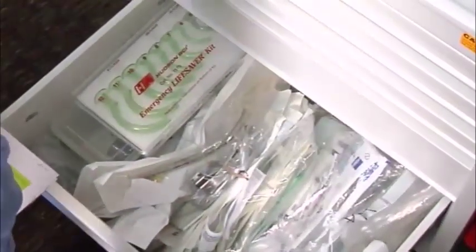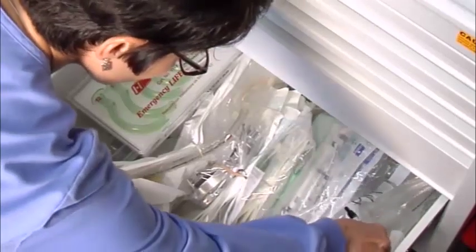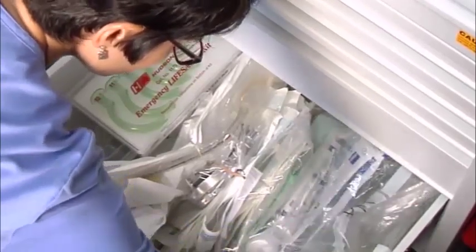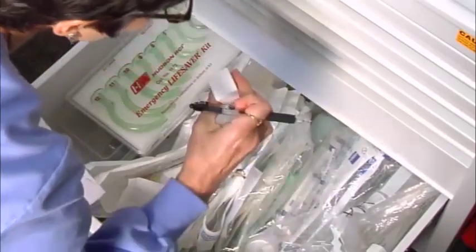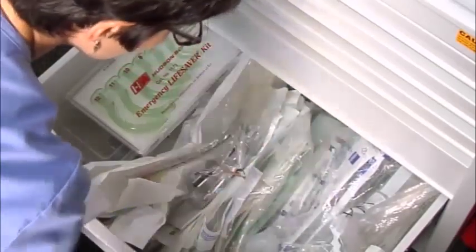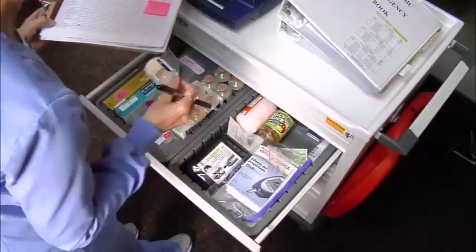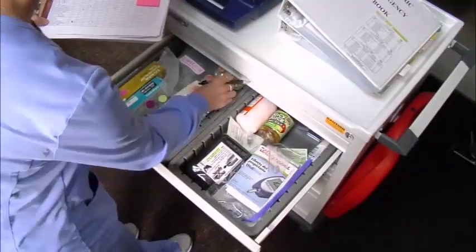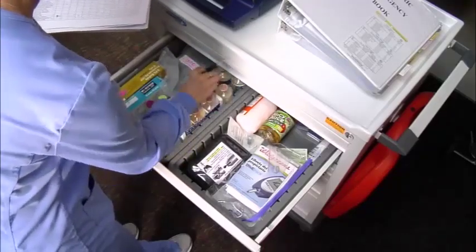The necessary equipment for airway management is essential. The team must have immediate access to an array of oral and nasal airways, an LMA, a laryngoscope, appropriate endotracheal tubes, stylets, and McGill forceps. The remaining emergency items, including IV solutions, second-line drugs, and so forth, should be placed where convenient. A backup light source or flashlight is appropriate in the emergency cart.